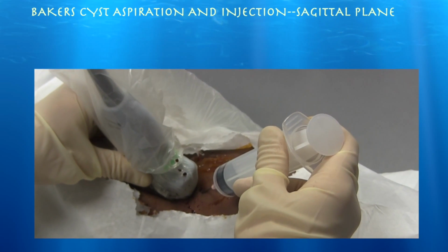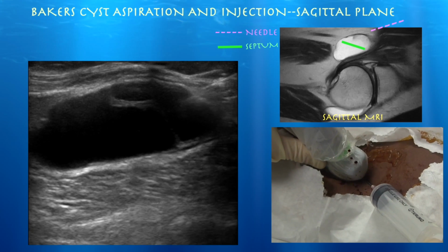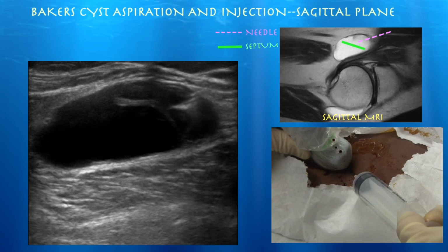That was not painful. That's me just going in. Okay, we're starting our procedure.